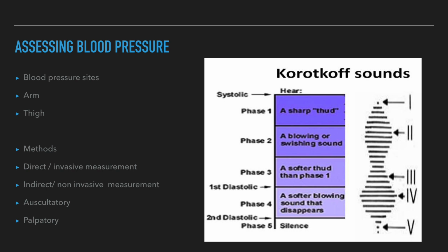Lower extremity. The blood pressure would be measured in the lower extremity if the client had arteries in the upper extremity that could not be palpated, if the upper extremity was covered by dressings or splints, if the client had a PICC line, or if the client had a mastectomy. Wrap the cuff around the thigh or above the ankle. Thigh pressure measurement requires a larger, appropriately sized cuff. Place the client in a flat, supine position with the cuff centered mid-thigh over the popliteal artery. Auscultate or palpate blood flow at the popliteal fossa.